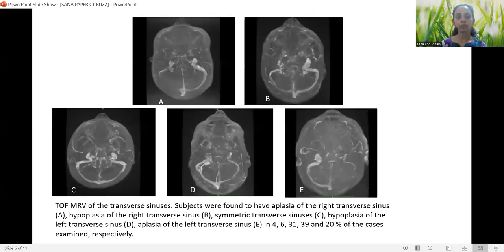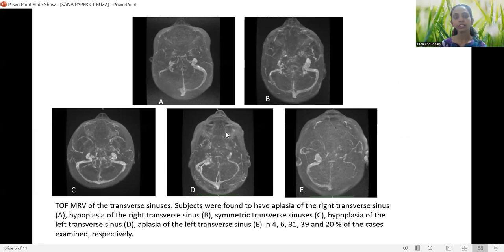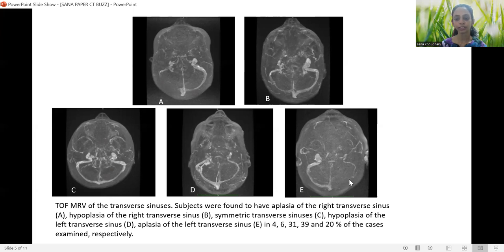These are the MR venography images of the transverse sinuses. Subjects in Group 1 had an aplastic right transverse sinus, Group 2 had a hyperplastic right transverse sinus, Group 3 had bilateral symmetrical transverse sinuses, Group 4 had a hyperplastic left transverse sinus, and Group 5 had an aplastic left transverse sinus.